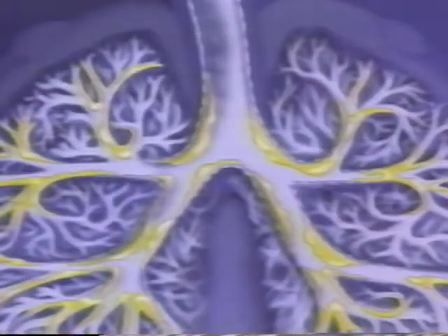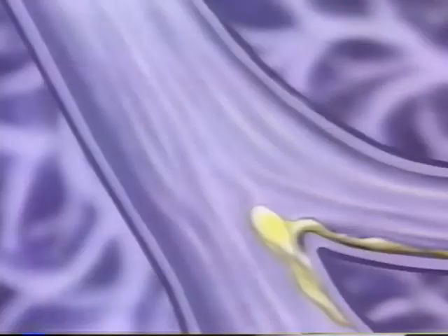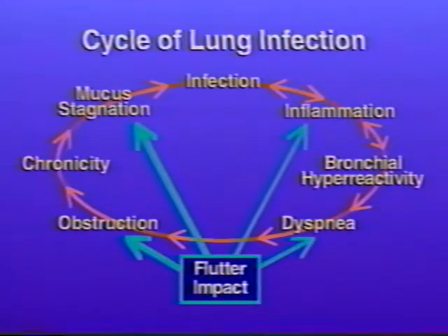In many chronic pulmonary conditions, there is a buildup of secretions in the airways. These secretions, if left in your airways, block air passages, make breathing difficult, and provide an ideal environment for bacteria to multiply and thrive, all a primary cause of progressive, irreversible lung damage. Therefore, airway clearance is critical to your overall care. Daily airway clearance with the flutter can help break this cycle of lung infection and damage.